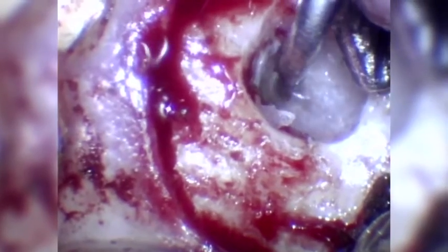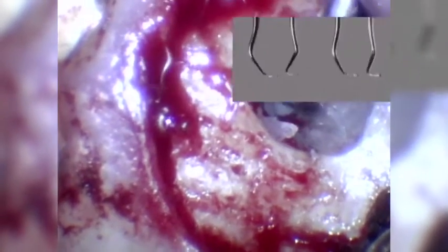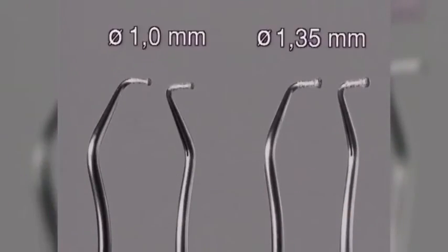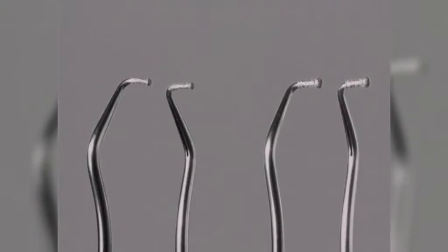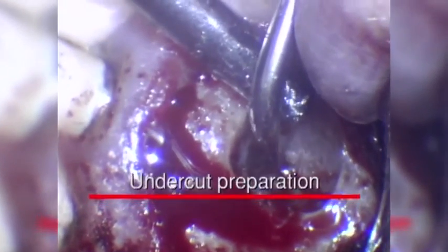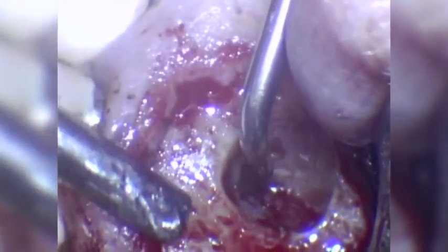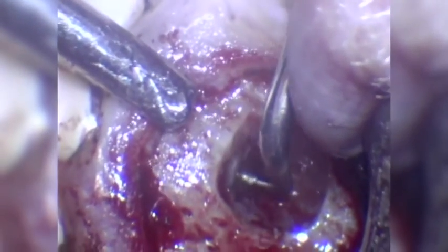The depth of the cavity must be at least 3 mm. This can be checked since the diamond coating on the tip is 3 mm long. The respective tip to produce the necessary undercut is chosen. The tip is rotated in a circular fashion circumferentially within the apical portion of the canal to ensure an adequate groove is prepared. This is then tested with an angled probe, for example, a Briault probe.